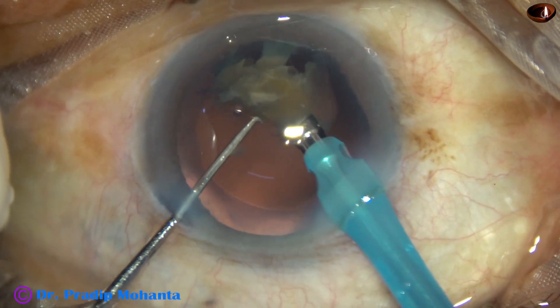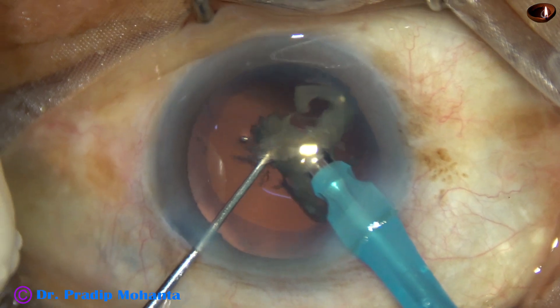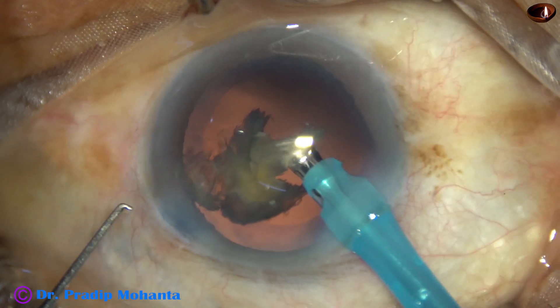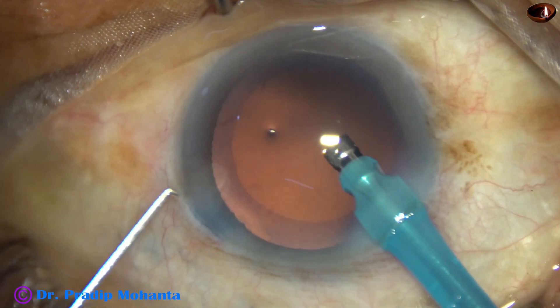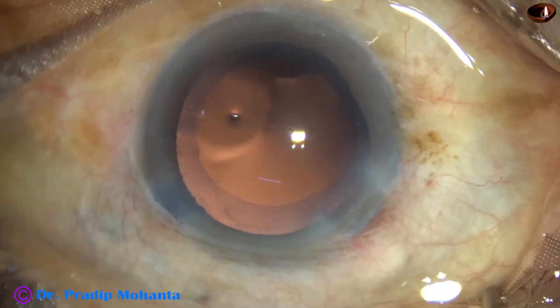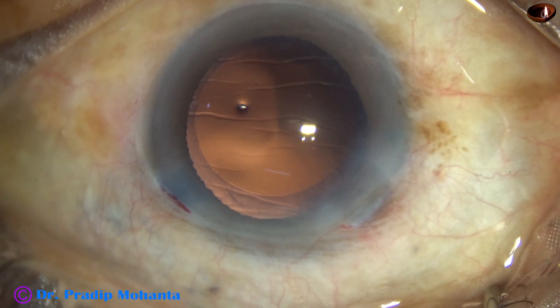This is the most tricky part of nucleus management. At this time, if we have any doubt of trampolining of the posterior capsule, we can manage the last piece by IOL scaffold.